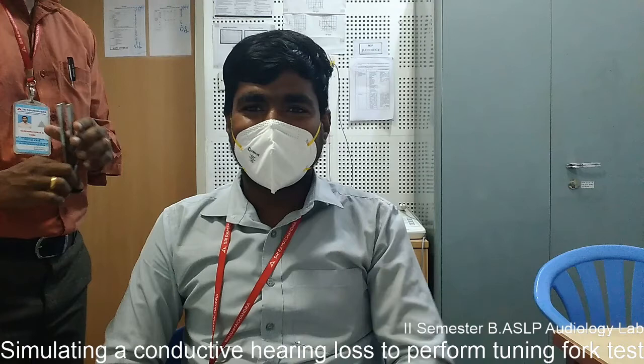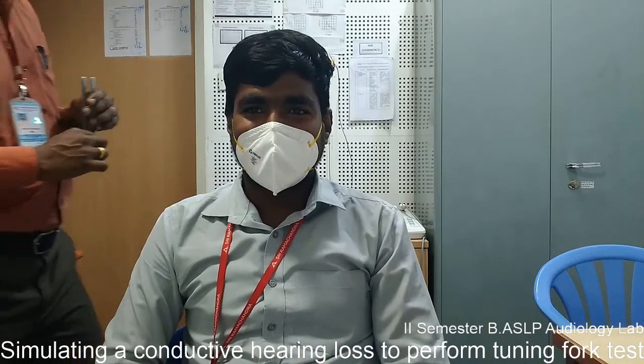Lateralization to the poorer side indicates that the lateralized ear has conductive hearing loss. So in this condition, the subject has either normal hearing or sensorineural hearing loss on the right side and a conductive hearing loss on the left side.